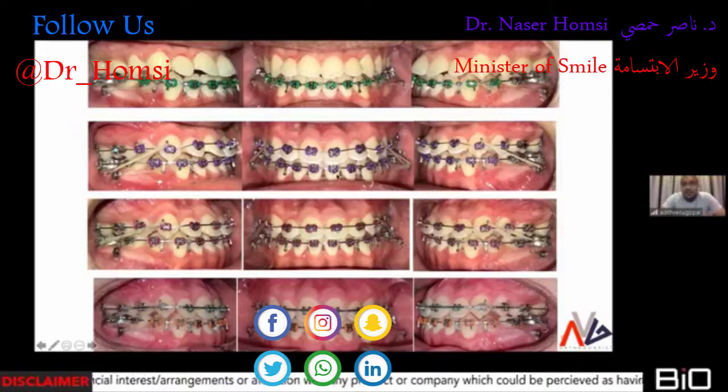And as and when I got good amount of overjet, I added in the upper brackets and started using light 5x16 elastics from the upper canines onto the lower buccal shelf, because I didn't want to procline the lowers.